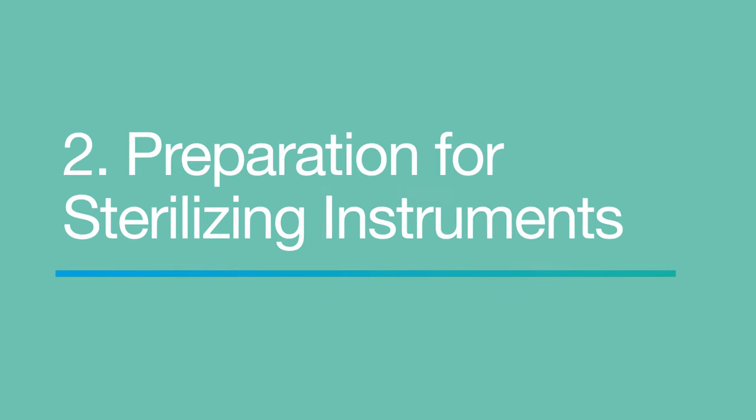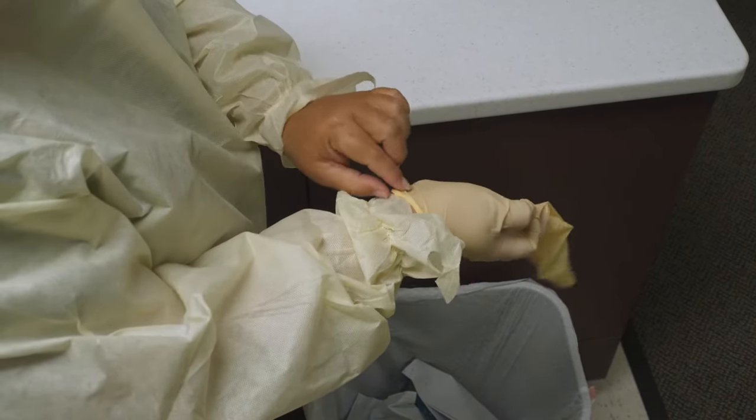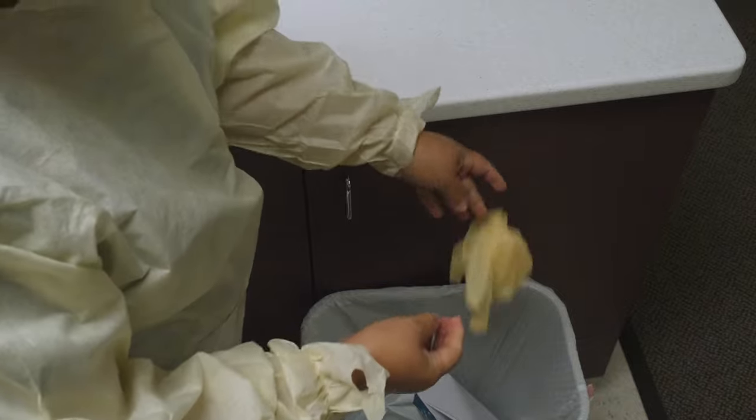When a dental procedure is finished, you need to prepare the contaminated instruments for sterilization in the instrument processing room. Remove your contaminated gloves, wash your hands, and put on clean gloves.